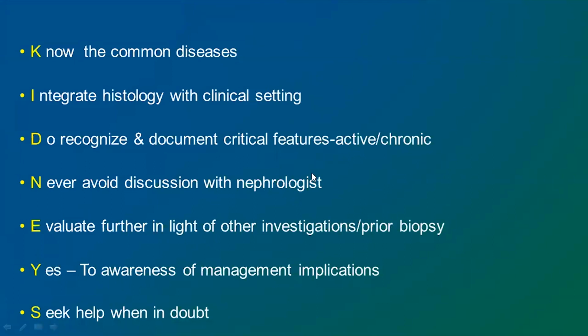So I would like to end by saying that when you're interpreting the kidney biopsy, know the common diseases, always integrate the histology with the clinical setting, do recognize and document critical features, especially the active and chronic features. Never avoid discussion with the nephrologist. Never ever sign out the biopsy without discussing it with the nephrologist. Not a single biopsy should go out without discussion.